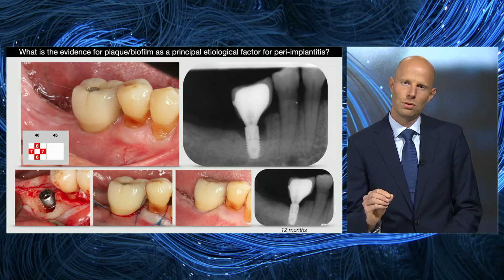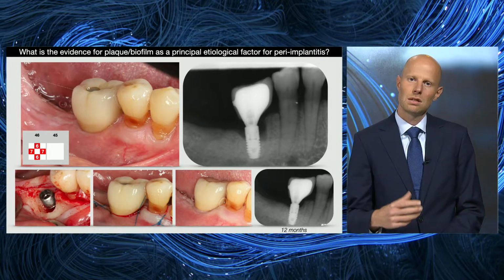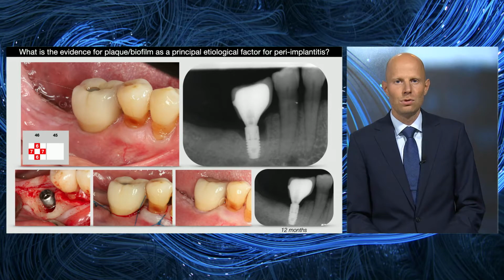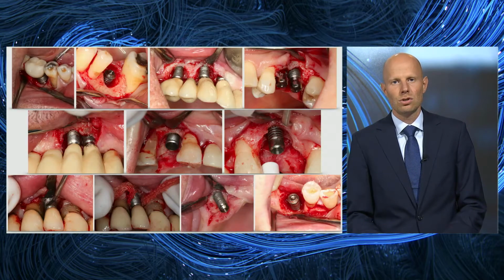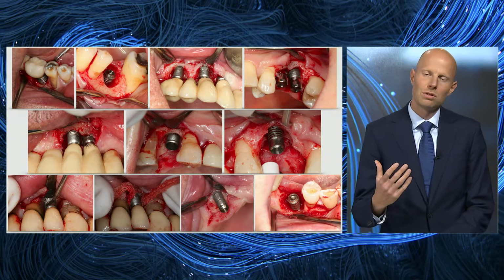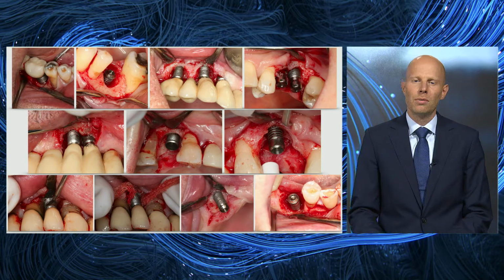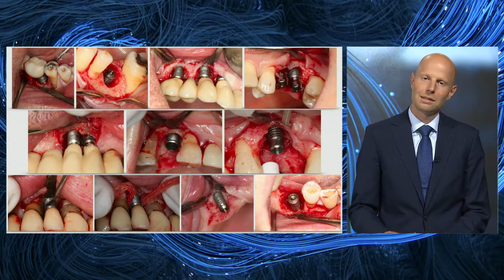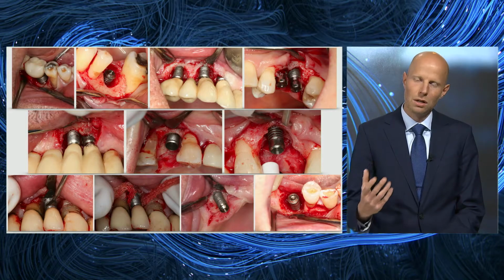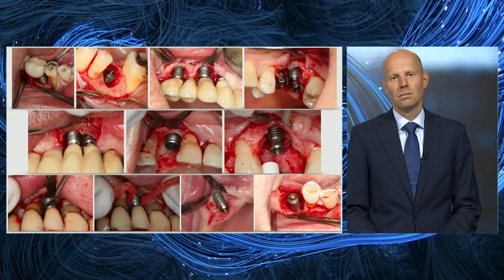And let me point out to you that no bone graft was used in this case. This is an open flap debridement. When I say anti-infective treatment and cleaning, these are some clinical illustrations of what I mean. So we have a contaminated implant surface, and you see to the lower left the important tool that we use, a rotating titanium brush that cleans these implant surfaces. And just by looking at them, the clinical impression shows you that the surfaces are clean.